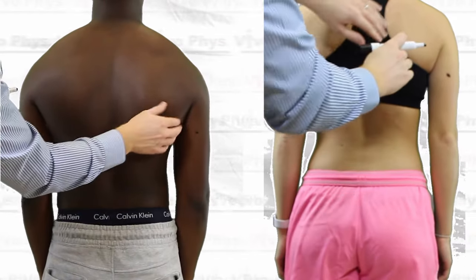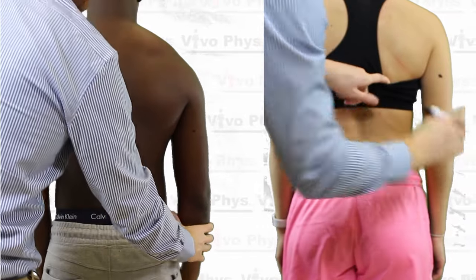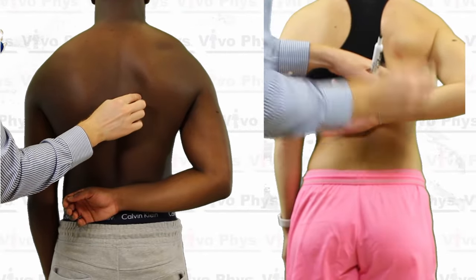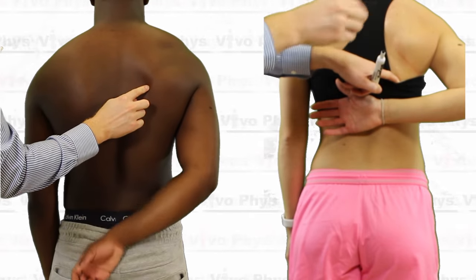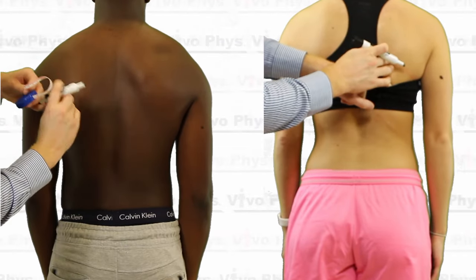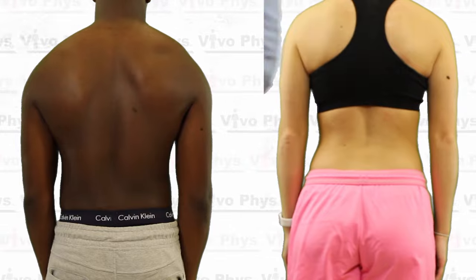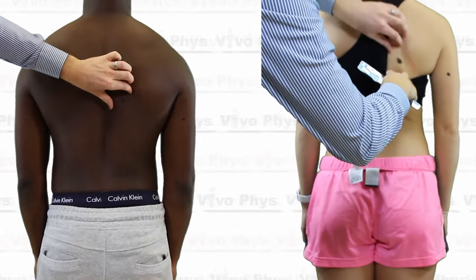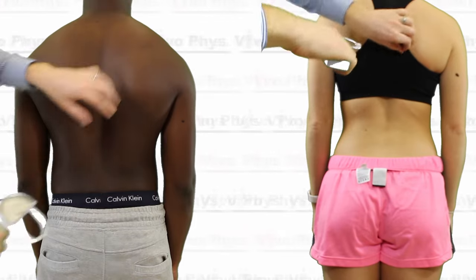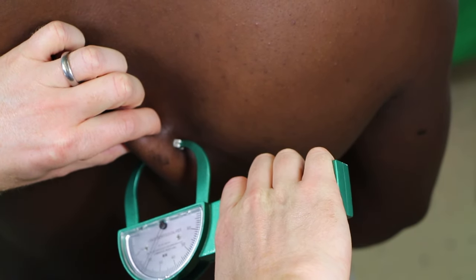In order to do the subscapular skin fold site, go to the back of the individual and look at the right side of their back. You're looking for the point of the scapula where the medial border near the spine and the inferior border of the scapula meet. If you're having difficulty feeling that border, have the person take the right arm and put it back behind their back — that's going to force the scapula to go out towards you. Make sure though that you have the person relax their arm back down and trace with your fingers as the scapula moves back to its resting position. Once you find the appropriate site on the scapula, go about one inch or two centimeters down and out away from it in a diagonal fashion — that's where the skin fold site is going to be, and this is a diagonal skin fold.